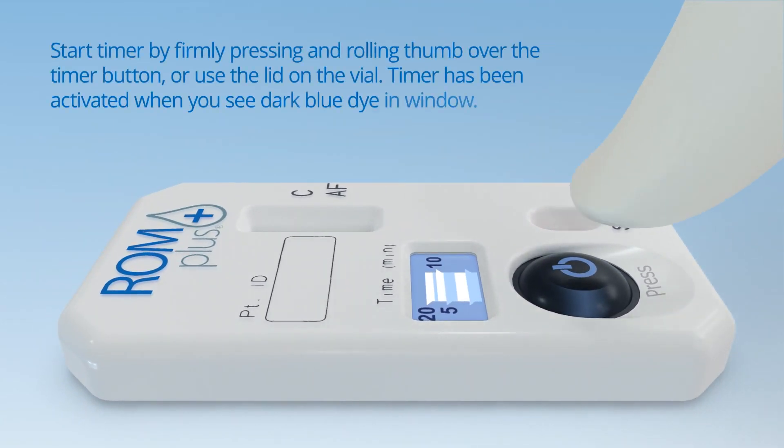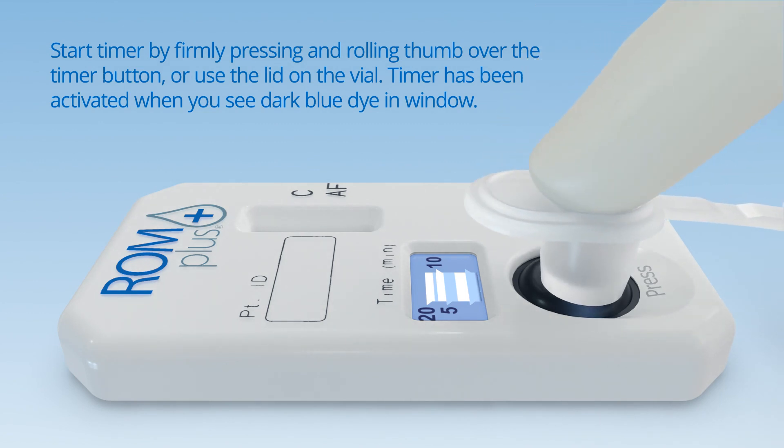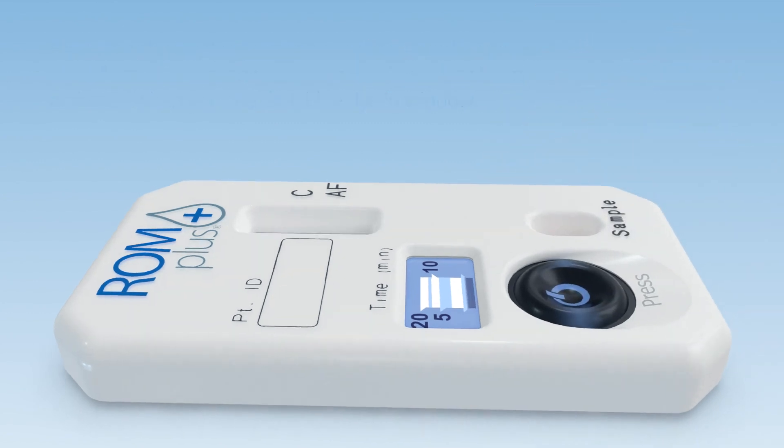Start the timer by firmly pressing and rolling your thumb over the timer button, or you may use the lid on the vial. The timer has been activated when you see dark blue dye appear in the timer window.